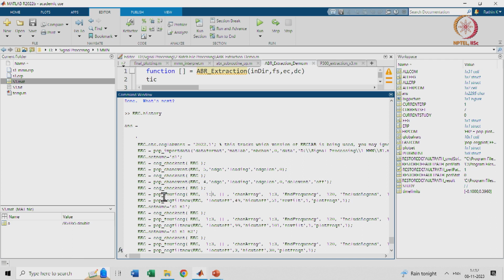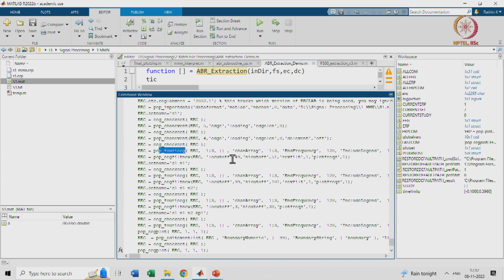Then we plotted the amplitude spectrum. This is the amplitude spectrum function. We realized that there is a line artifact, so we removed 49 to 51 Hz with a notch filter. The reverse filter is 1. We plotted the frequencies and amplitude spectrum, and we named the dataset S1N1.